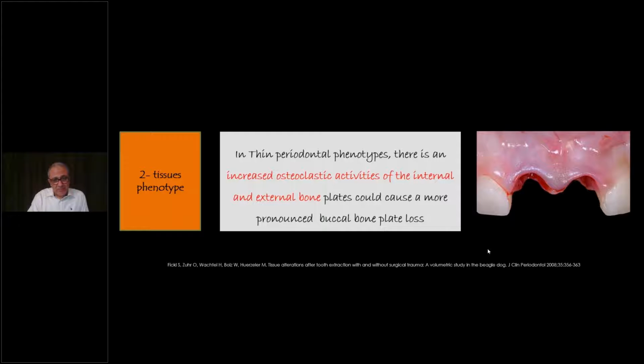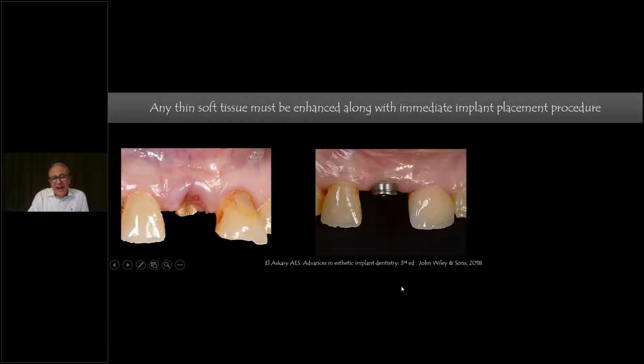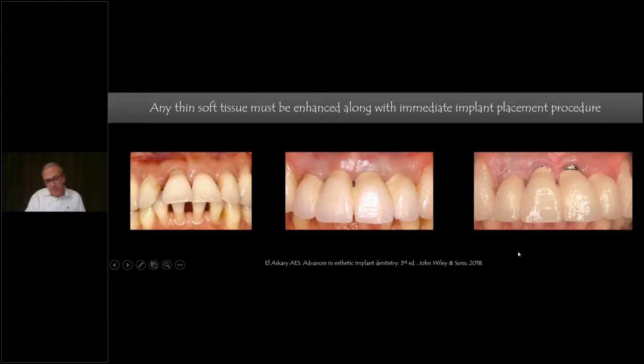Look here, this is a very thin case, and look at this implant being placed here. This is what I expect. I can show you hundreds of cases that you can see without enhancing the soft tissue prior to or along with implant placement, you will end up always like this. Doesn't matter when, but it's going to happen. Today, tomorrow, after 1 year, after 2 years, but it's going to happen.